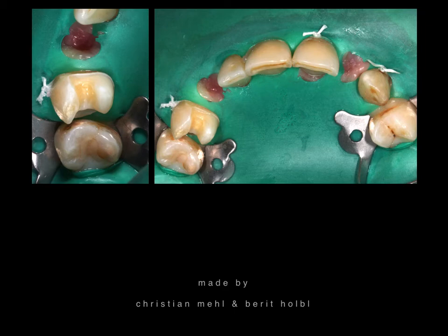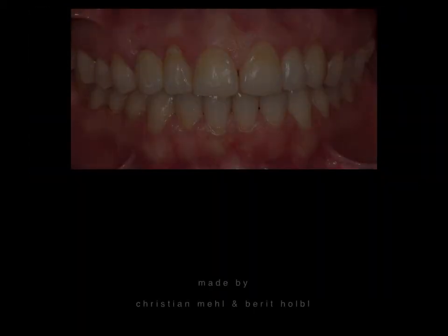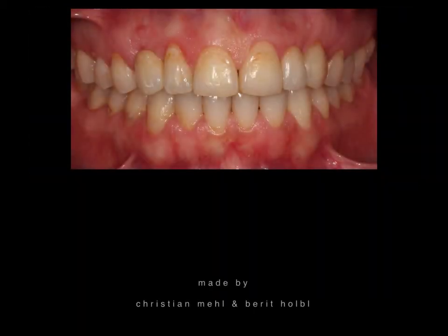The bridge is placed under rubber dam — this part is a little tricky and has to be done absolutely perfectly for the bridges to last a long time. We use special cements for that. On the day of placement, pictures were taken. We placed the bridges and did a small composite filling for the deciduous tooth. You can barely see our bridges — on the left side you can see it slightly because of a shadow due to the gum situation, but on the right side there's no chance of seeing anything — tremendous work by the dental technician.